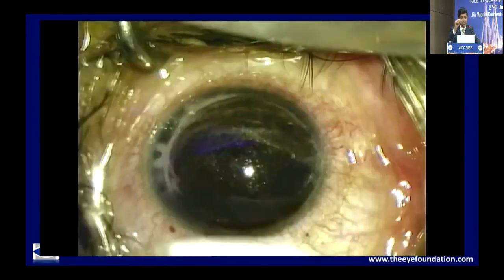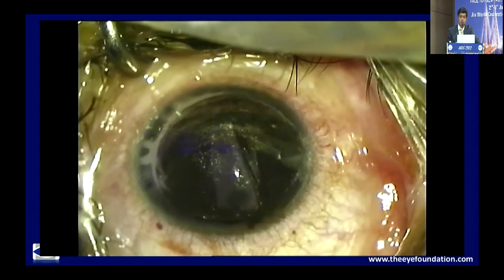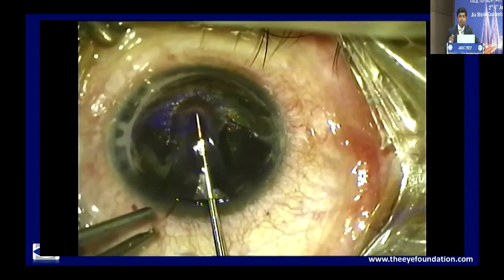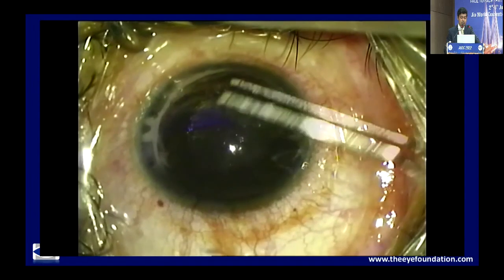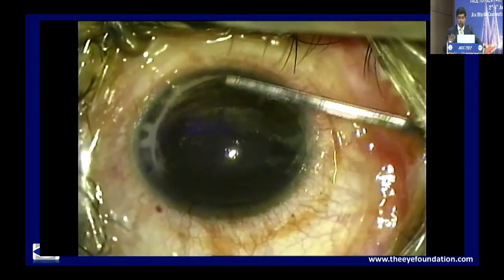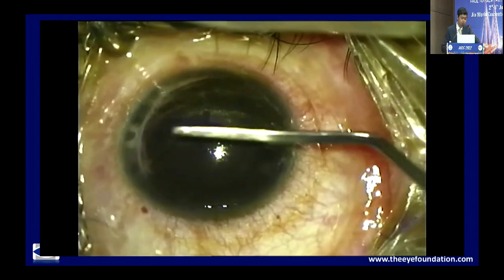It's not like the anterior chamber, so you can't really slide it out so easily. So using a flat instrument like the one which he showed, or using just an iris repositor, is a better idea, so that you can push it in nicely. So you can see just a flat iris repositor, and then massaging the lenticule and ensuring that it is completely centered on the center of the pupil on the Purkinje image is useful.